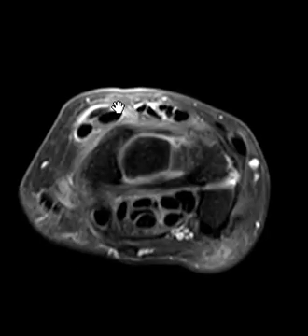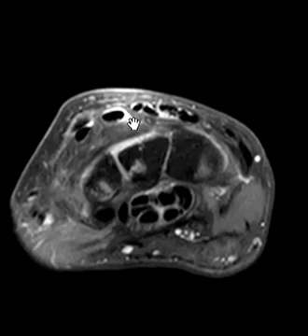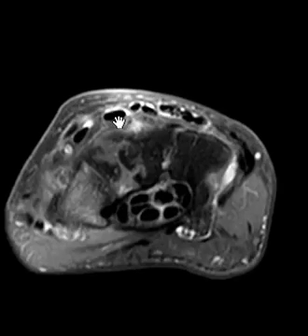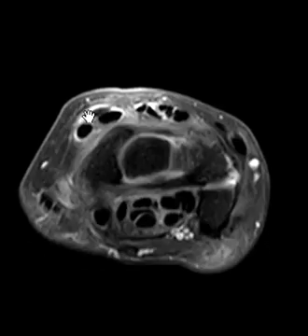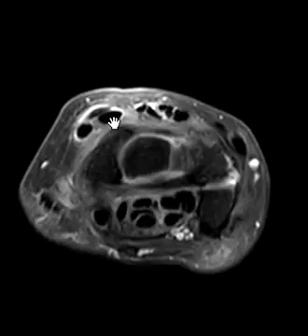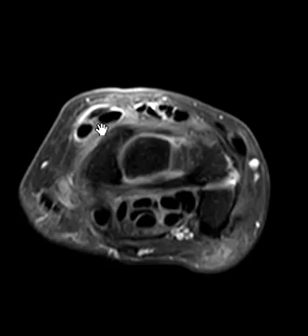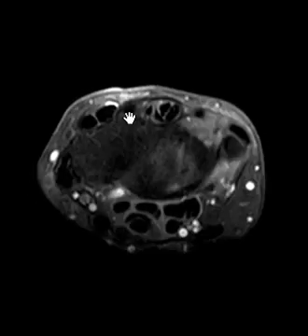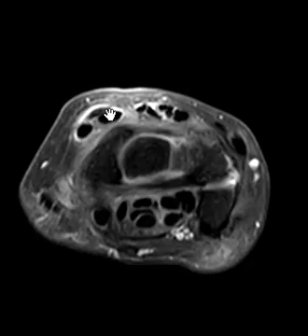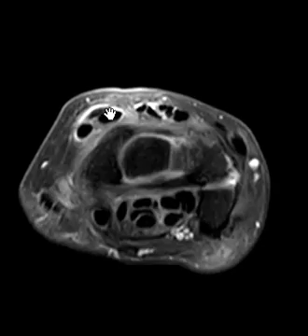Tenosynovitis is just fluid in the tendon sheath — tendons usually look normal. We can see here along the dorsal aspect of the wrist there's a little bit of fluid in the tendon sheath, so we're like, oh, this is it — they've got tenosynovitis. There's no tendon tear, no history of trauma, and the tendons themselves look nice and dark, but there's just a little bit of fluid.